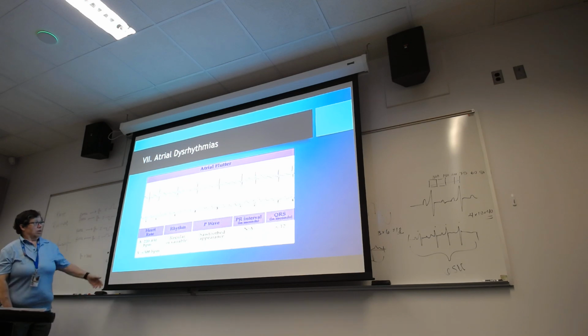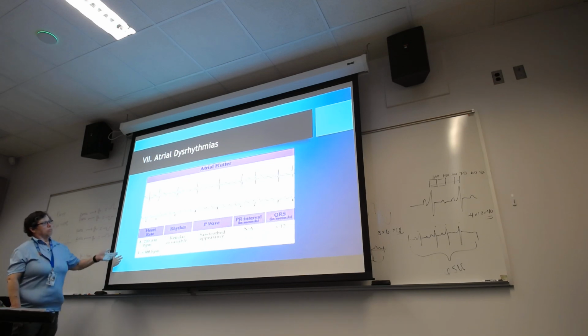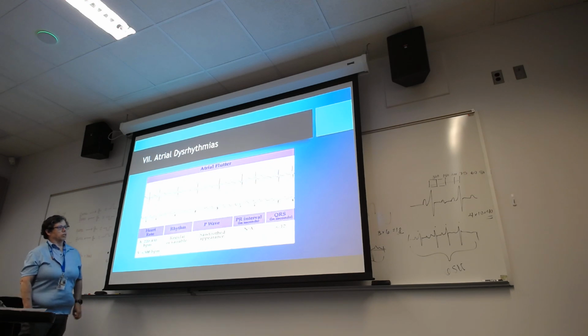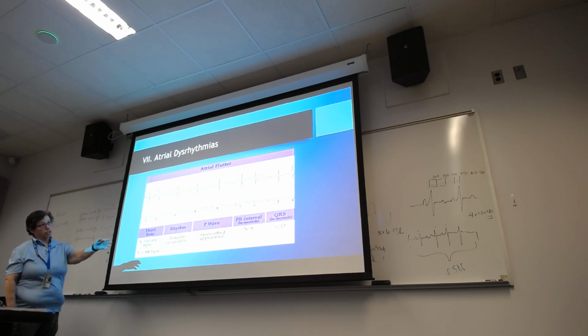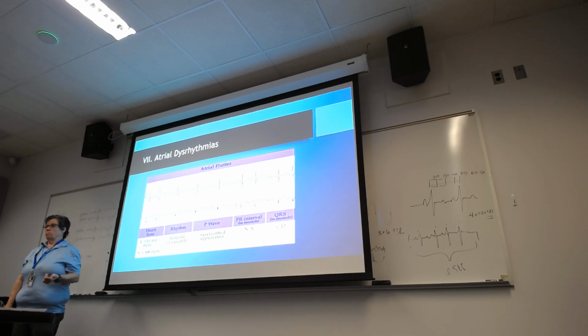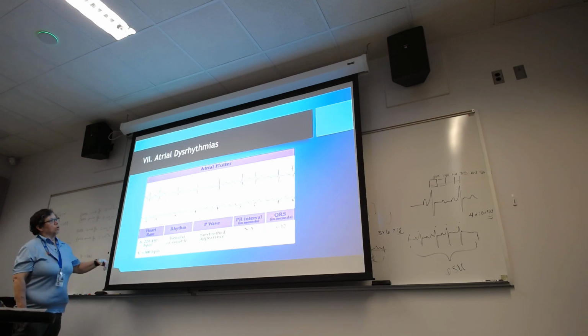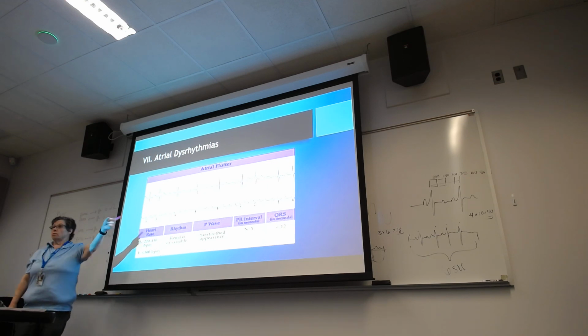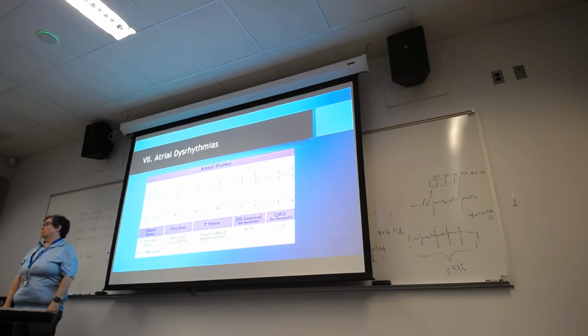So when you're looking at heart rate, you say, wow, there's not that many of those QRS complexes. So your ventricular rate is different than your atrial rate. You think that can screw somebody up? Yeah, right? So the rhythm is irregular if you look at it, right? You can see that the R to Rs are not the same distance apart from each other, right?